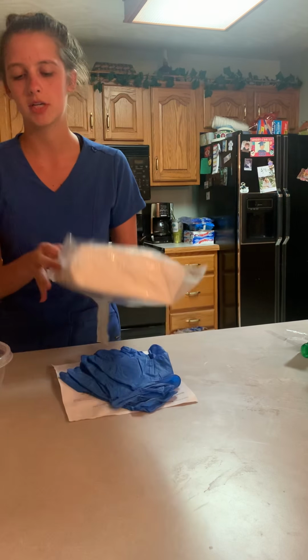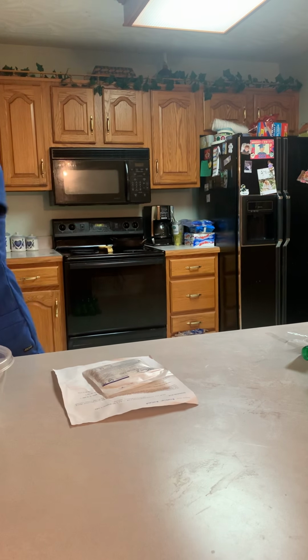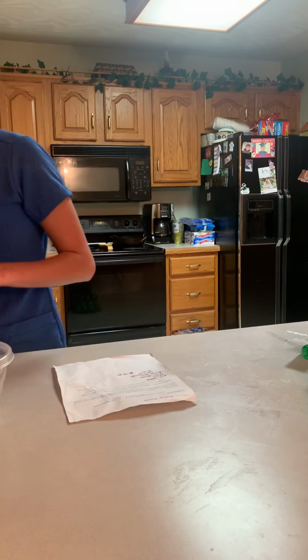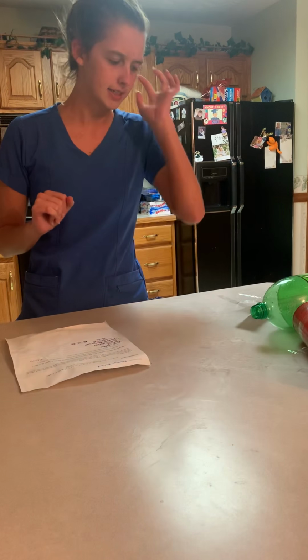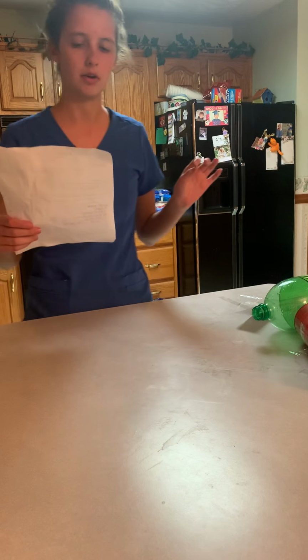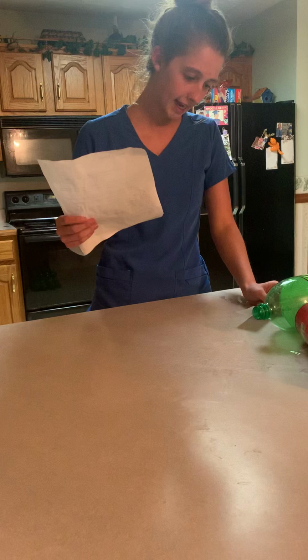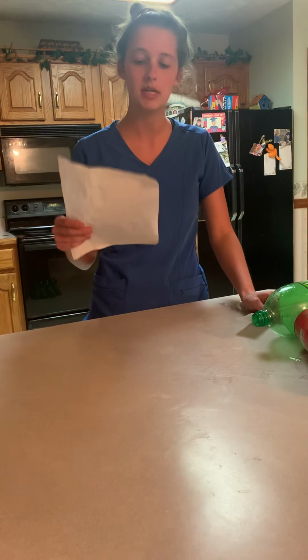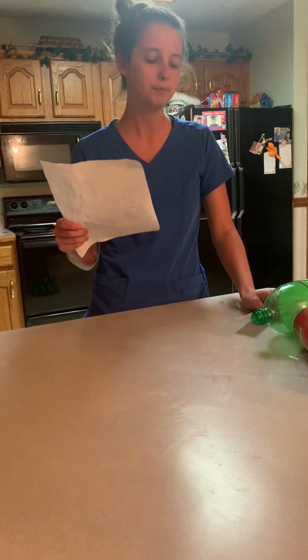Okay, so next what I'm going to do is compare the patient's ID band against the healthcare provider order. So the patient's name on the patient ID band is Ren Harami, and the patient's name is Ren Harami on the healthcare provider order.